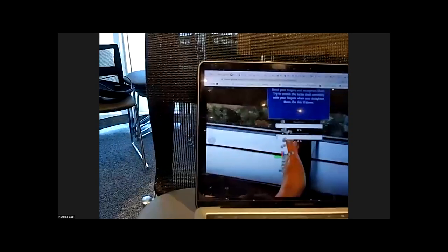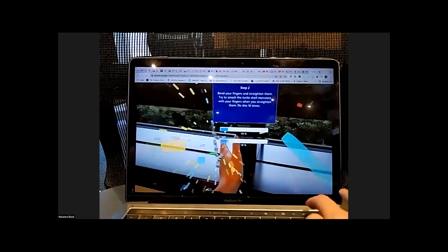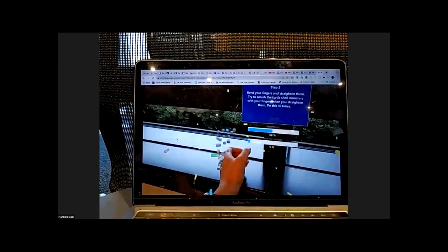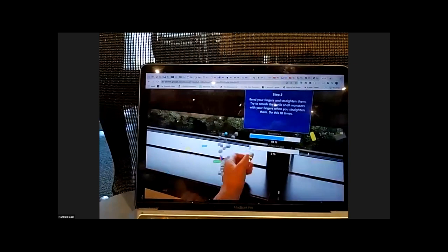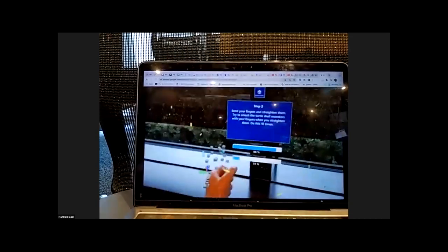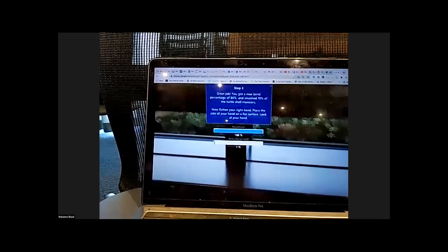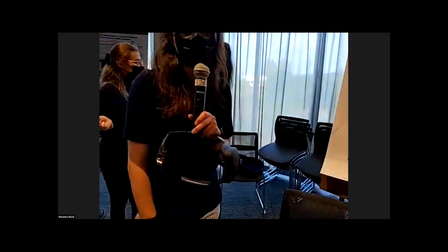This is amazing. Right, so you can basically just showing how we might go about making these really boring movements something a little bit more fun. So you flex your fingers out to smash the monsters, and it gives you information about how much you were able to bend your fingers and how many of the monsters you successfully smashed.